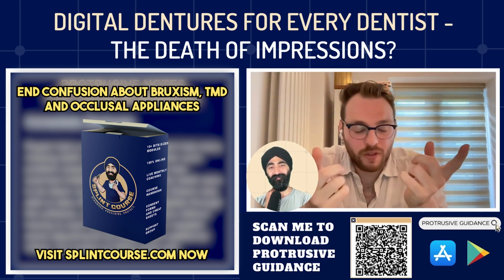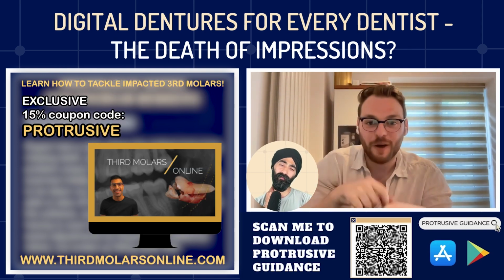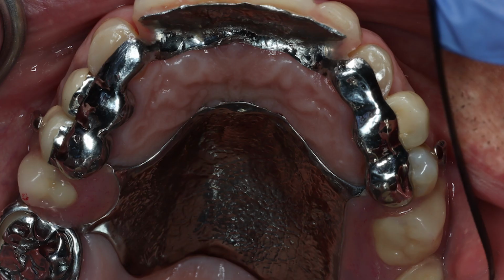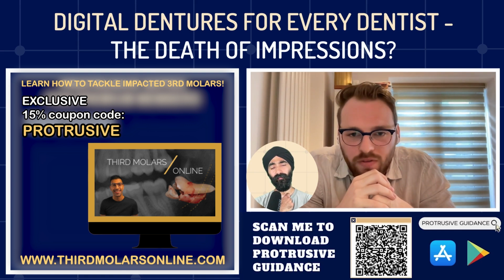And that was all over the place, but I just got the GC soft reline. It's a nice silicone material, and I just filled it up basically, and all the borders are silicone, but it fits like a glove still at 3 months. So it's an immediate, that's the reality of it. It works beautifully for scanning.